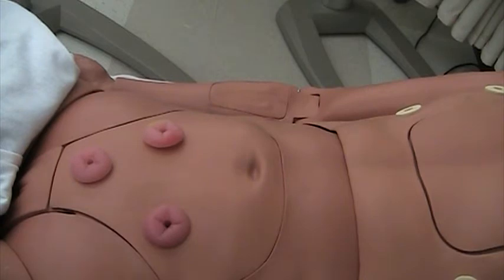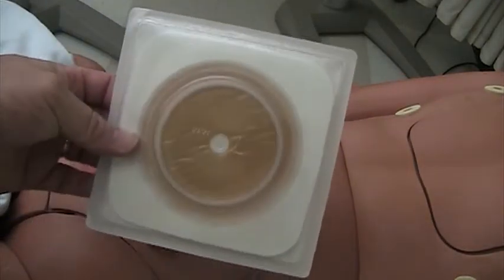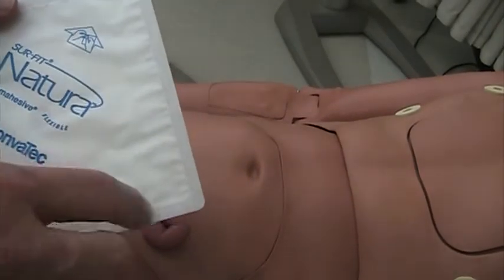So some of our supplies that we have to get to take care of ostomies is we need what's called a wafer. Your wafers can be made by different companies, but for the most part, this is a wafer. Sure fit, stoma adhesive.